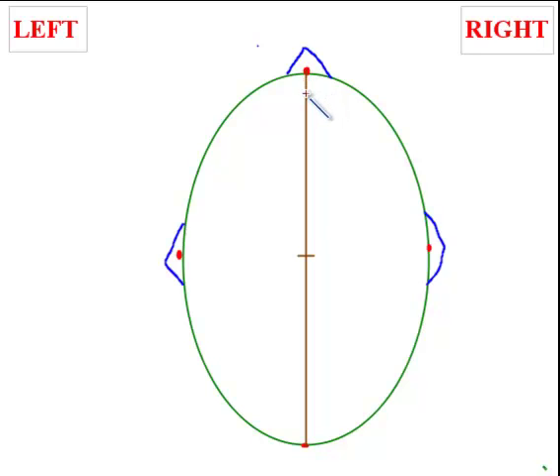You measure 10% from the nasion, so first you measure this whole length, and then you calculate 10% of this length, and put a mark here.